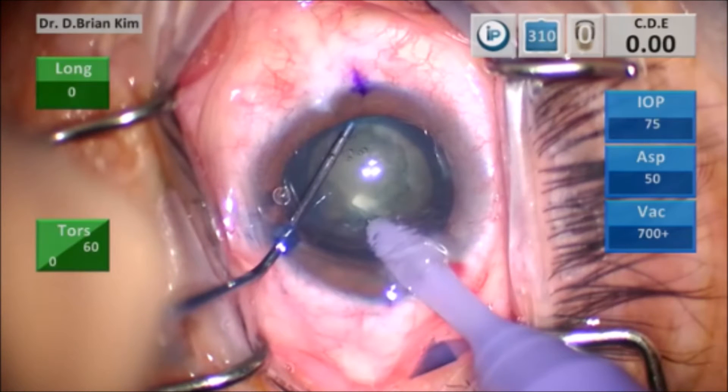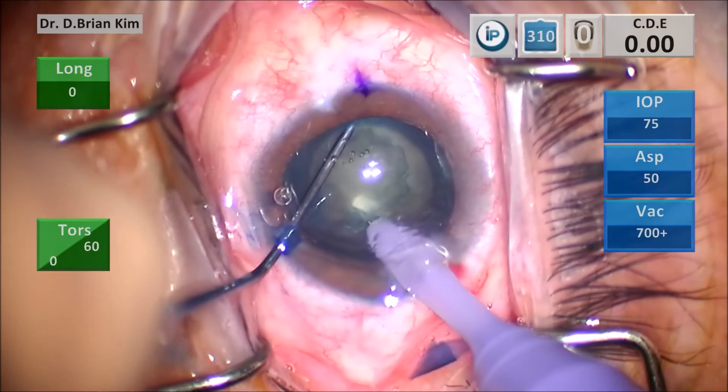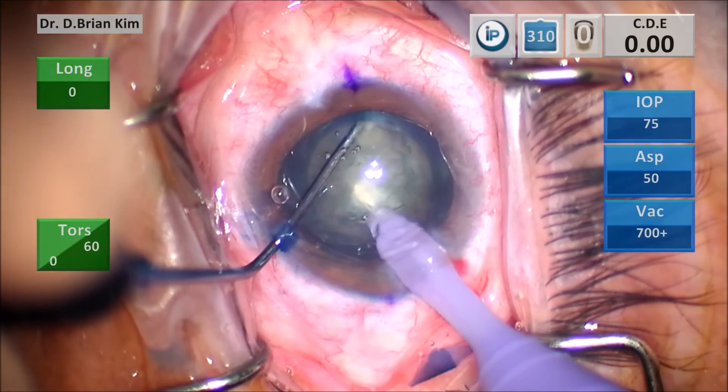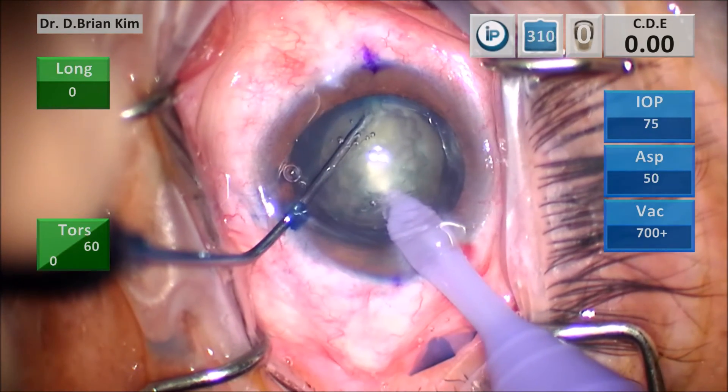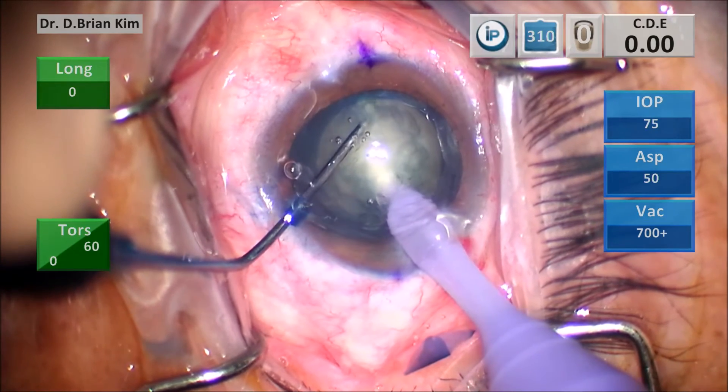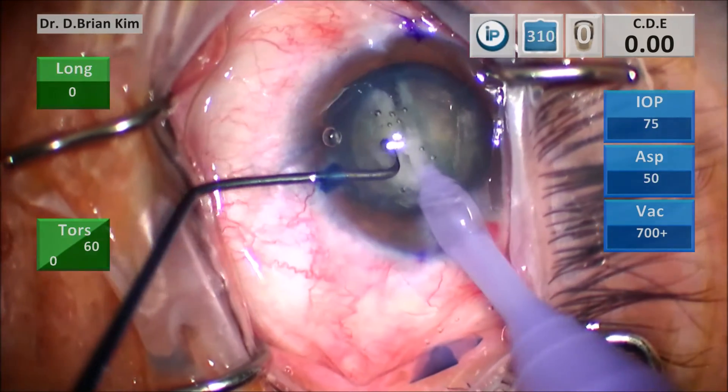So as you can see here, again, phaco tip is on the surface of the lens, but it's sub incisional. As I bring both instruments together in the middle, you see the whitening of the lens, and the lens is fractured.